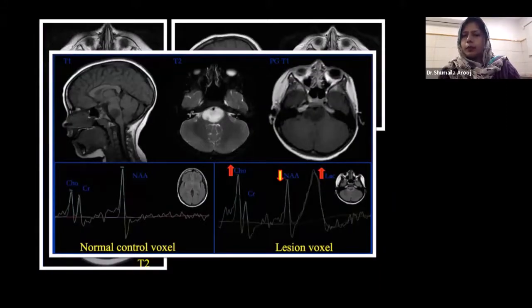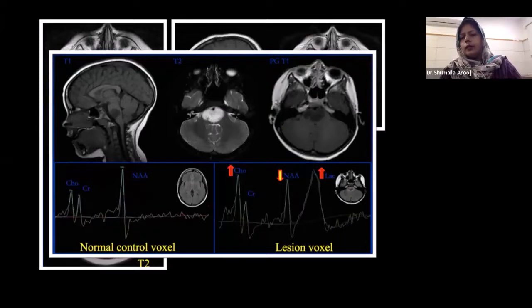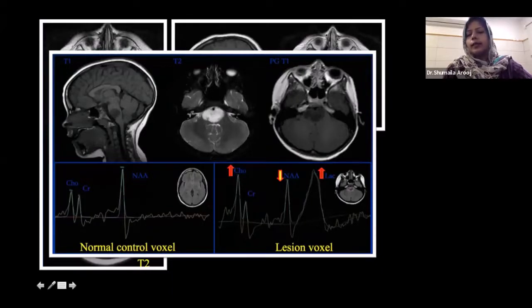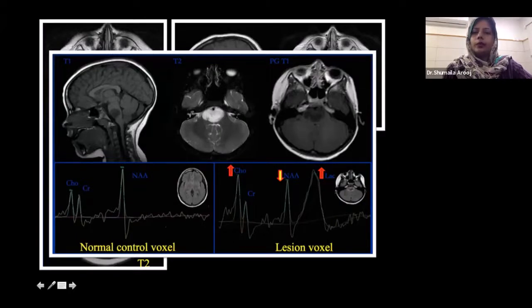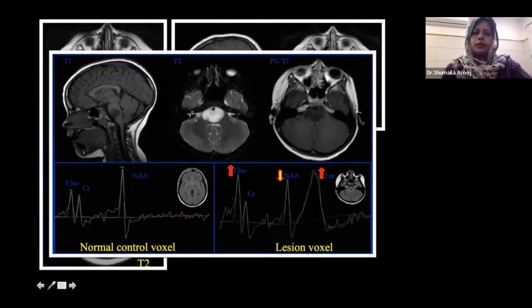At times people perform MR spectroscopy — our neurosurgery department is very fond of it. But unfortunately, we don't get very different results from the baseline images. Most of the time, what we are suspecting from baseline images, the spectroscopy gives the same picture. In tumors, just to give an overview: in normal glial tissue, NAA has the highest peak and choline and creatine have lower peaks with no lipid lactate doublet. When there is a lesion, the choline peak will be raised and NAA decreased, and due to internal areas of necrosis there will be a lipid-lactate doublet. Neurosurgeons find it very helpful and their literature supports that.